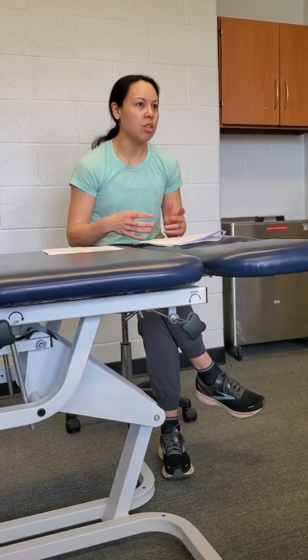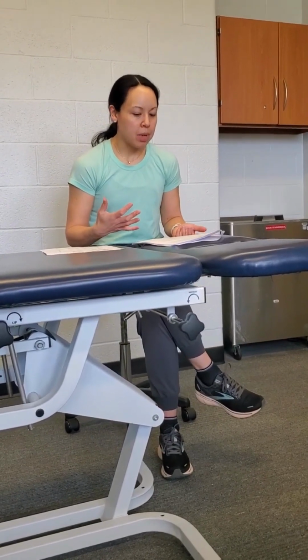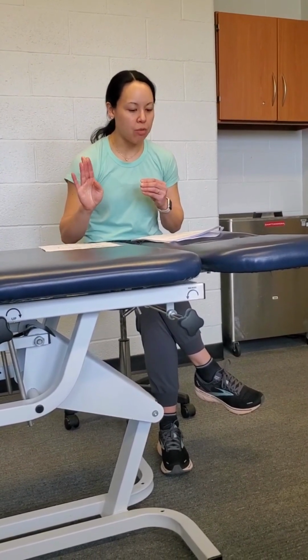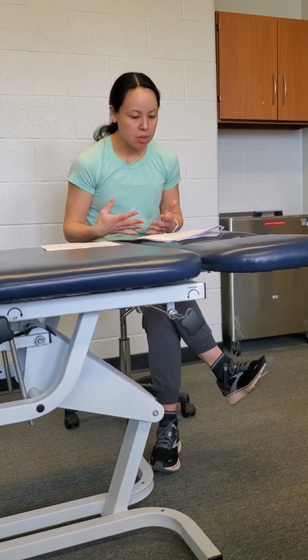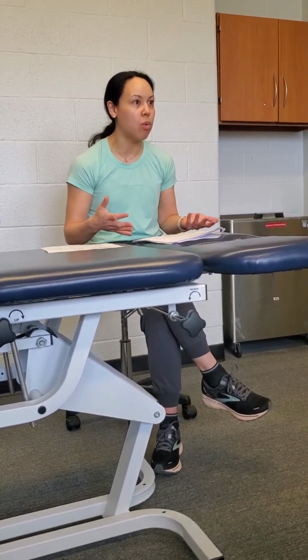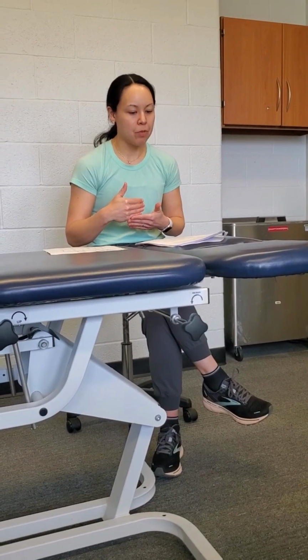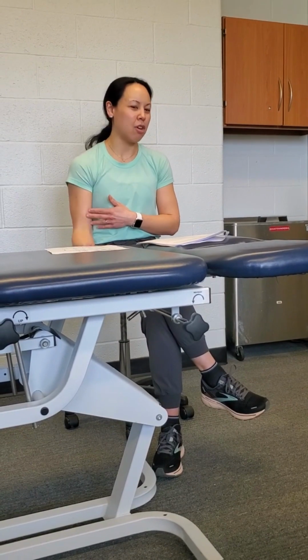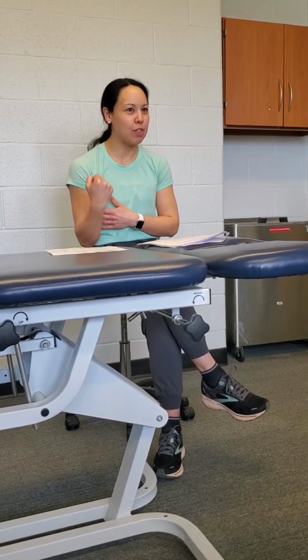Set 1 is always going to feel easier because the muscle still has oxygen in it. Then set 2 and beyond will feel much harder as the muscle becomes deoxygenated, and this will activate the fast twitch fibers, which is the goal. We want them to fatigue to failure. They're going to be feeling that muscle burn and just struggling. By that 15th rep each set, they're going to be like, I don't want to do it anymore.